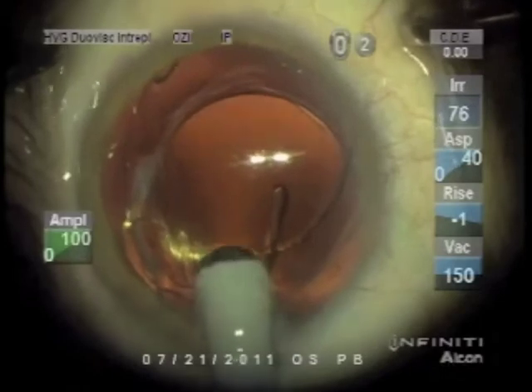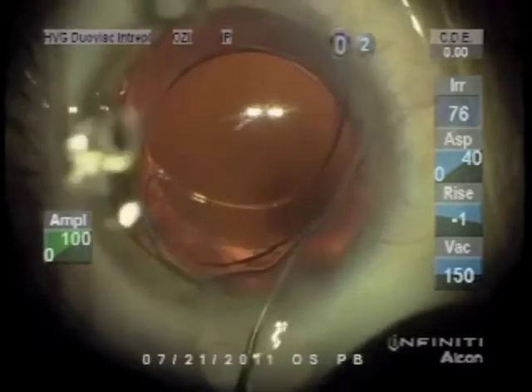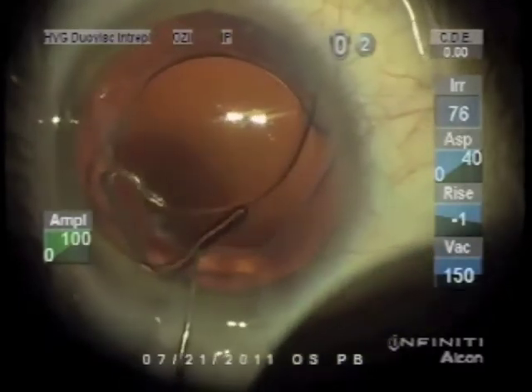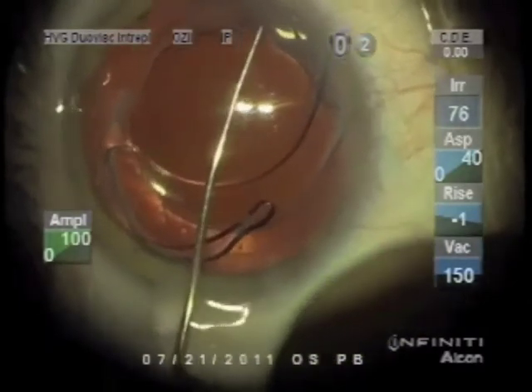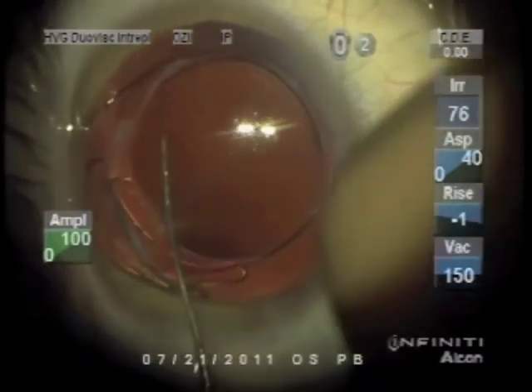The longer haptics and the concave shape of the posterior surface keep it away from the original lens — these features are ideal. You can see the long curved haptics that are stable in the sulcus.